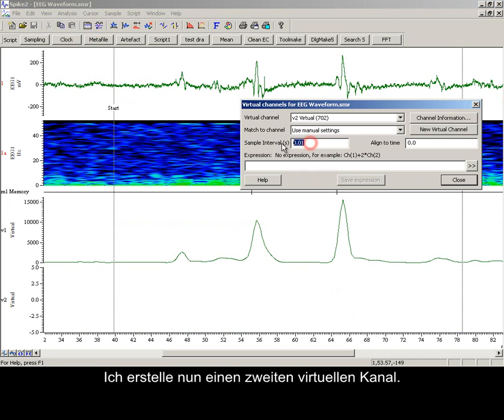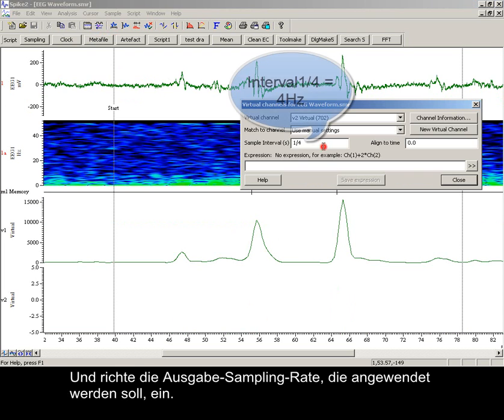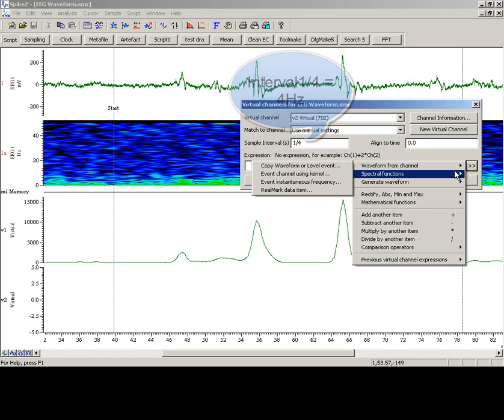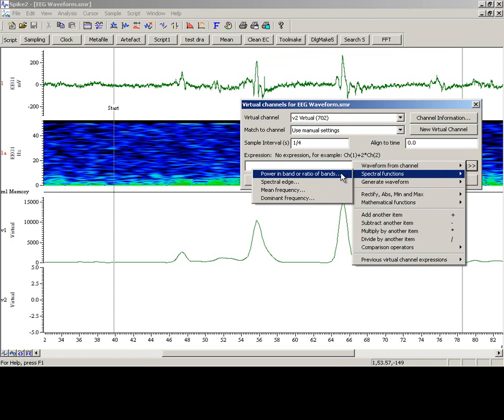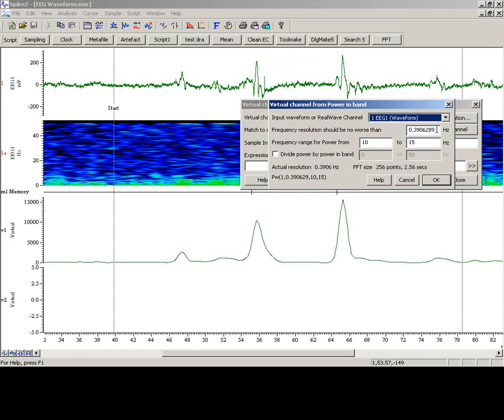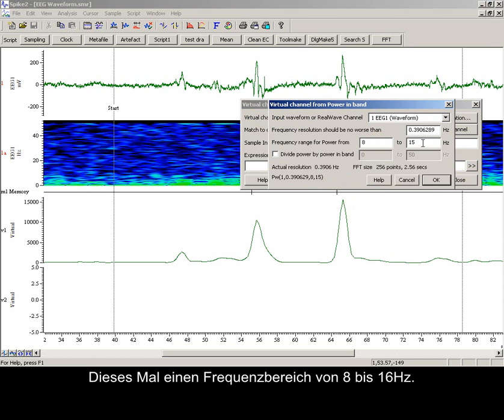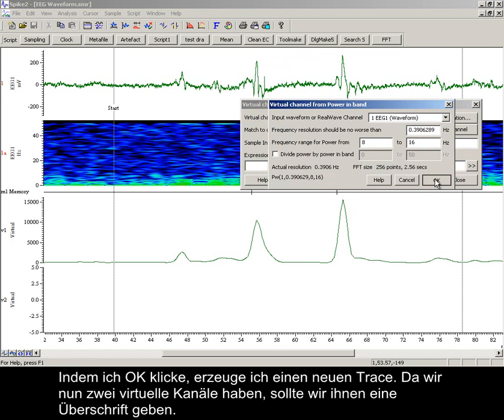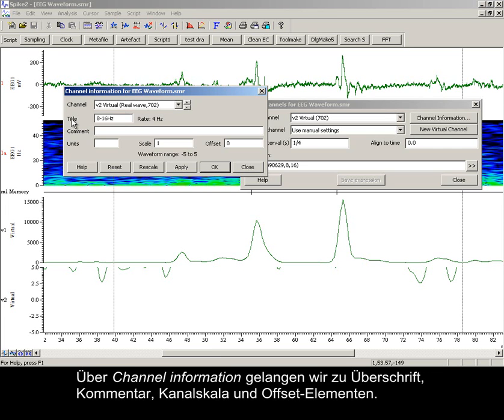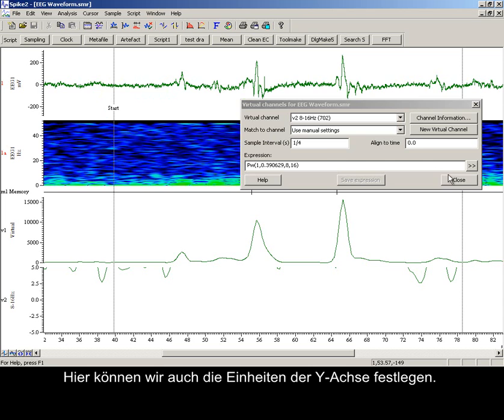Creating a second virtual channel now, setting the output sample rate and once again defining the expression. This time a frequency range of 8 to 16 Hz. Pressing OK produces the new trace. As we now have two virtual channels, we should title them. Clicking channel information, we can access the title, comment, channel scale and offset items, and also define the y-axis units.